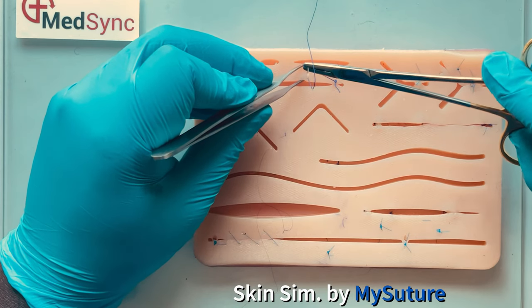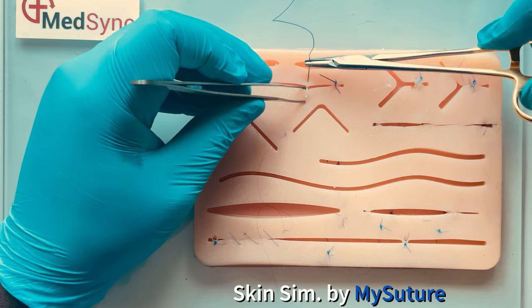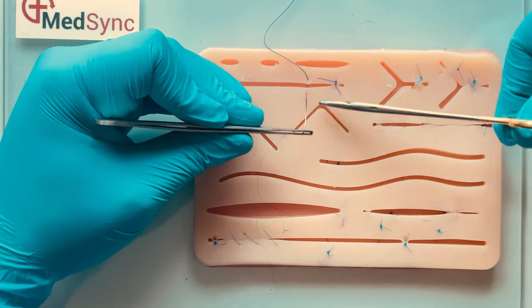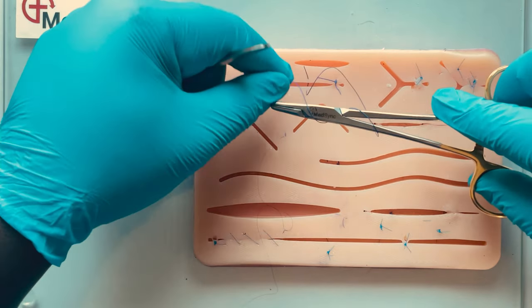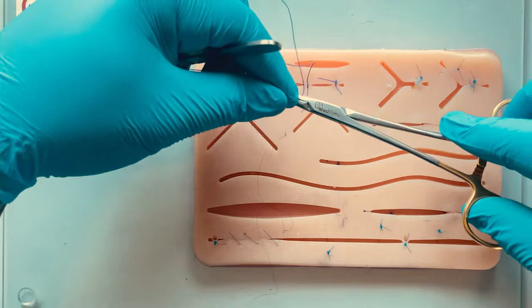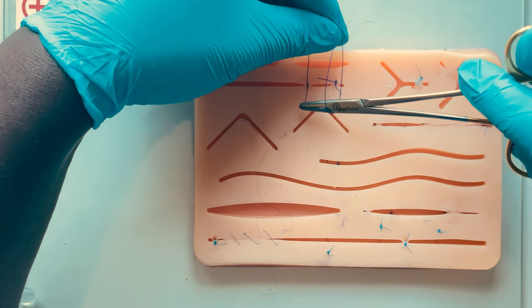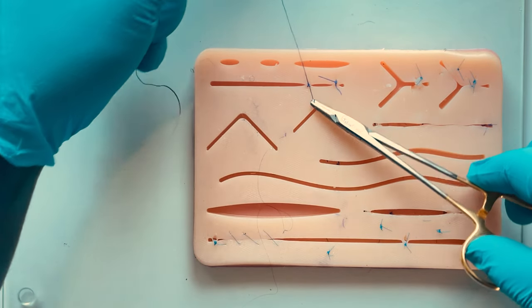Surgery should look effortless from the way you hold your forceps to how you pass your suture through the wound edges. When tying your knot you do not need to apply maximum strength, simply enough force to bring the wound edges together dermis to dermis, epidermis to epidermis.